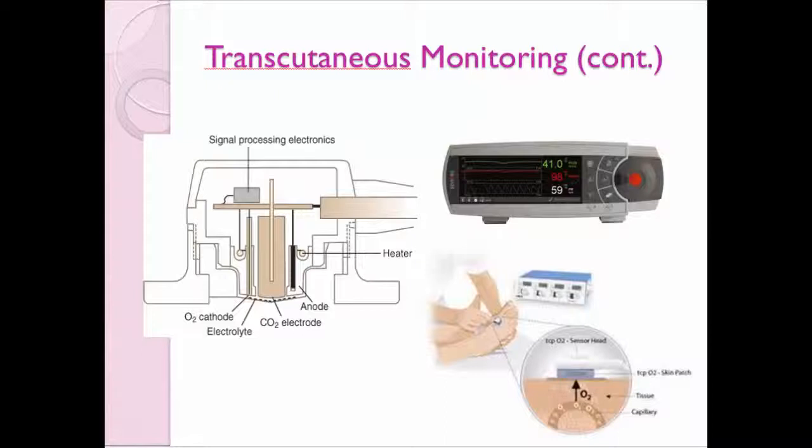But if they start changing, let's say the problem is at your knee in your leg, you would have one electrode placed on the upper leg, one on the knee, and then one down towards the foot. Well, if the knee is the thing that's swelling, then it's likely that the ones on the upper leg and the knee will be of normal value, and then the one at the foot would be decreased, and so you'd be able to watch the blood flow in an instance like that.